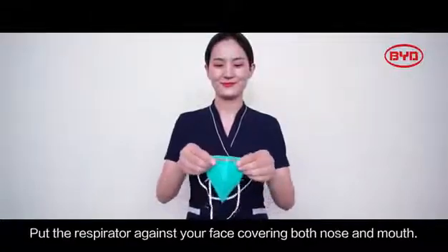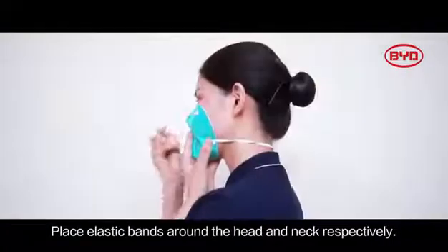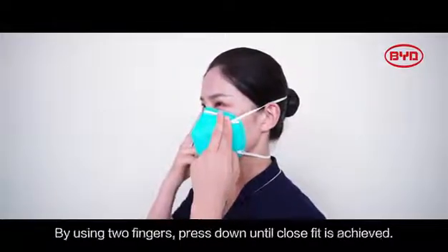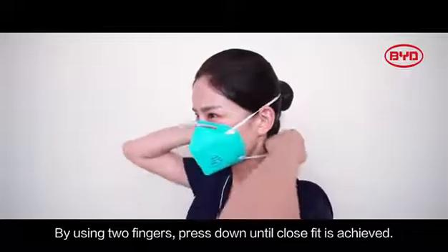Put the respirator against your face covering both nose and mouth. Place elastic bands around the head and neck respectively. Adjust the metallic strip over the nose bridge by using two fingers pressed down until a close fit is achieved.